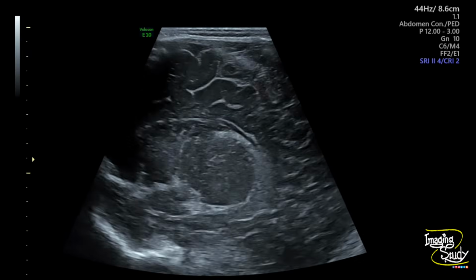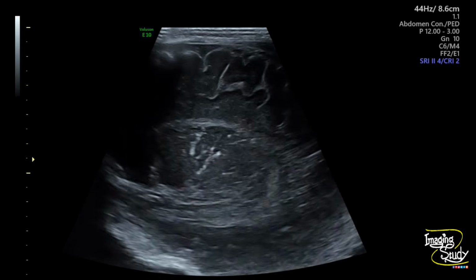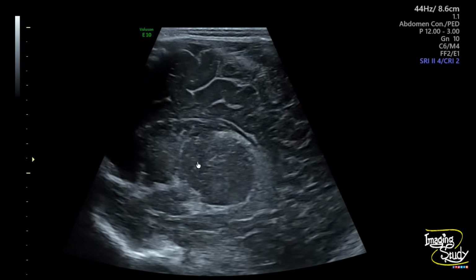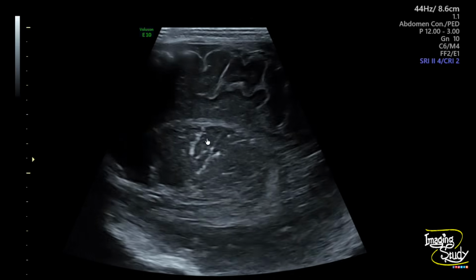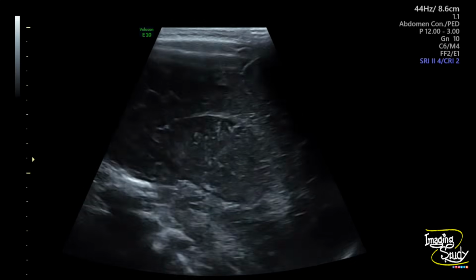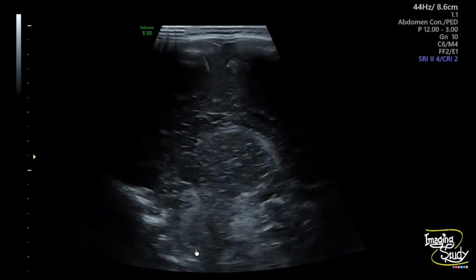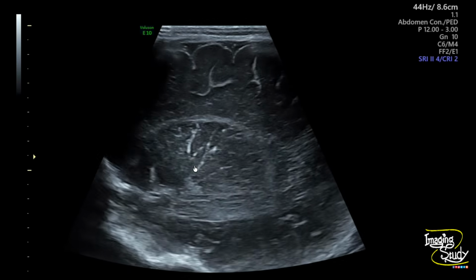But here you can see the high frequency ultrasound of the sagittal and parasagittal sections. Now you can see some echogenic linear stripes in the right thalamoganglionic region. These linear bright branching patches are the calcification of the walls of the thalamostriate arteries, which lie over here. Here's the opposite side. On the left, you can still see these linear echogenicities indicating calcification of the thalamostriate arteries.